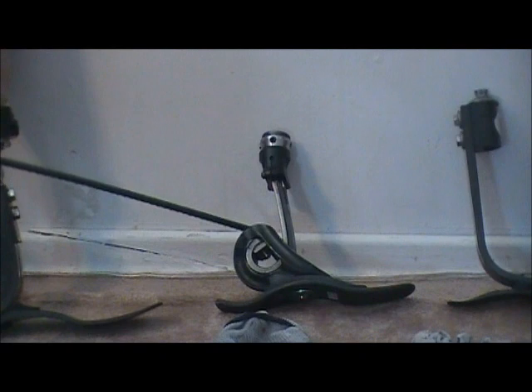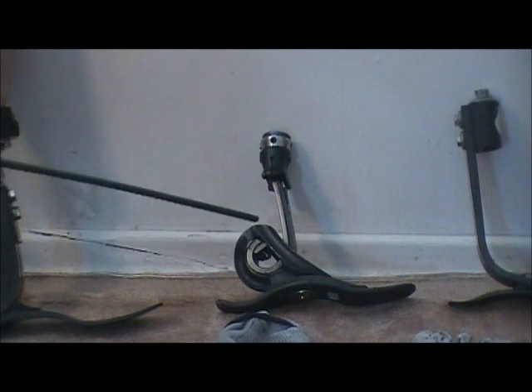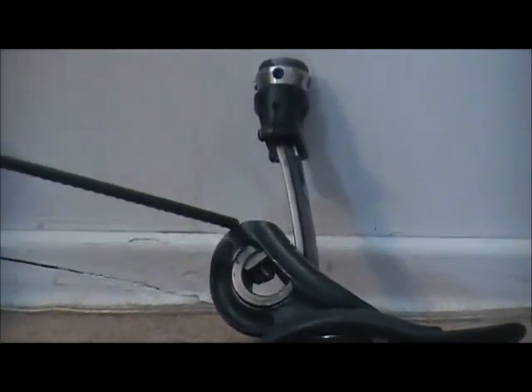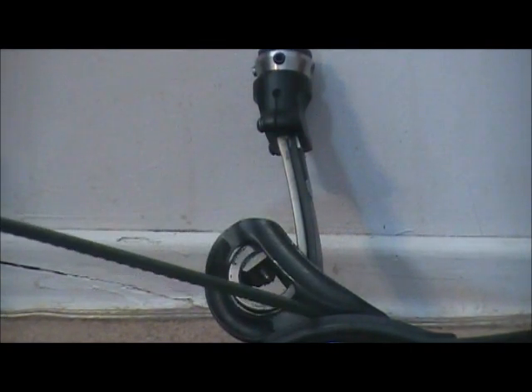The heel height adjustment is right here. The problem I had when I used this foot is the heel height would slide out of place, and you couldn't tighten it enough to keep it at the height you wanted. Other than that, I really like this foot.